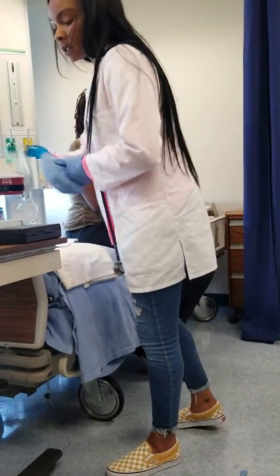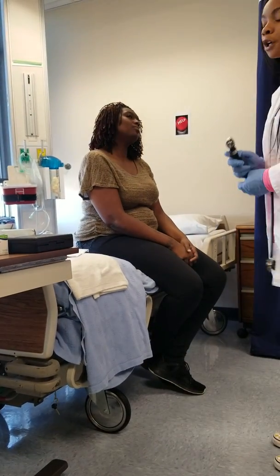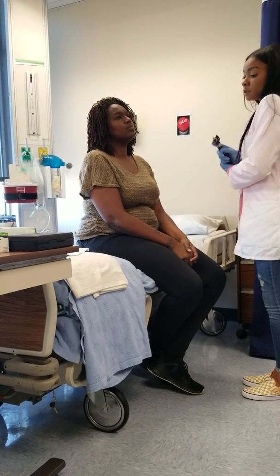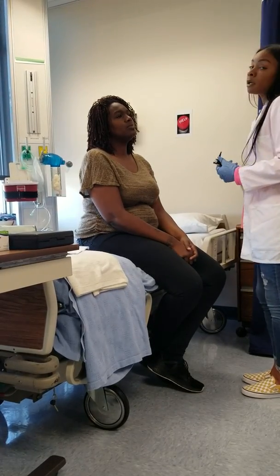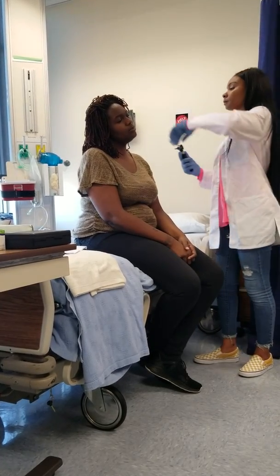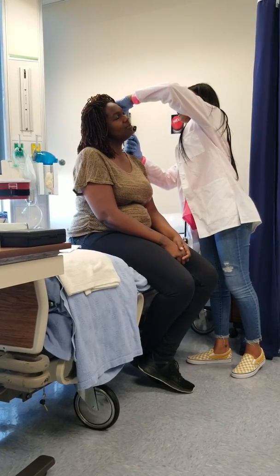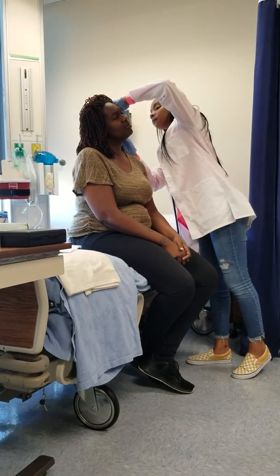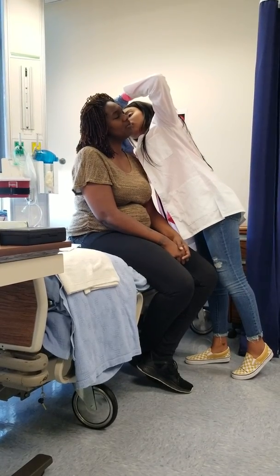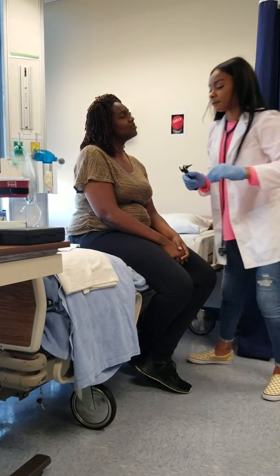We're going to continue the assessment of the head, neck, and throat. We're going to assess her ears. I've already made sure that her auricle is movable and so is her tragus. Now I'm going to look at her canal and tympanic membrane. Because she's an adult, I'm moving her ear up and back. Pearly and gray.